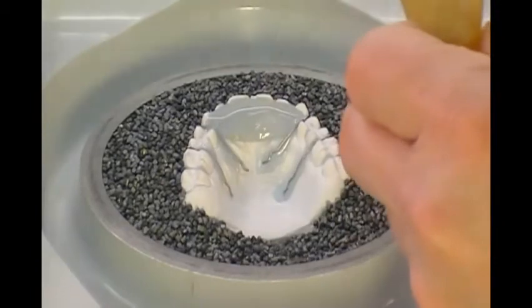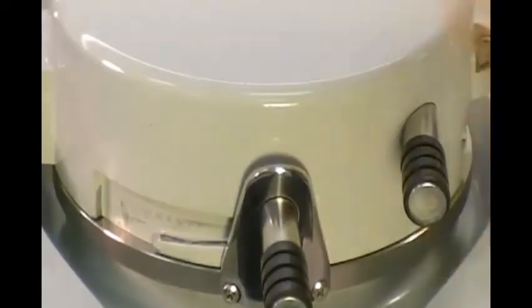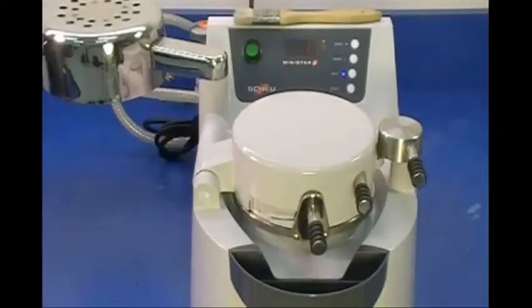Once the heating time has ended, swing the lamp to the back of the machine. Then rotate the chamber over the cup and lock into place. Allow form material to cool and acrylic to cure for 2.5 to 3 minutes.